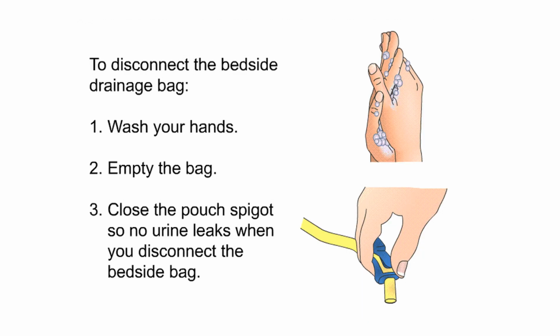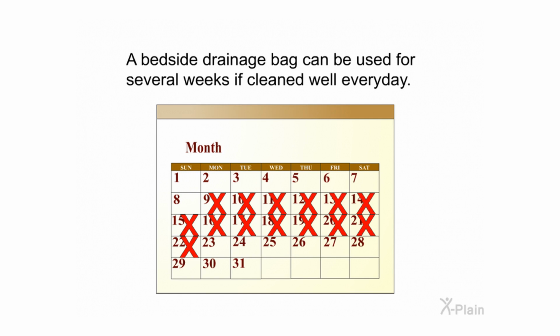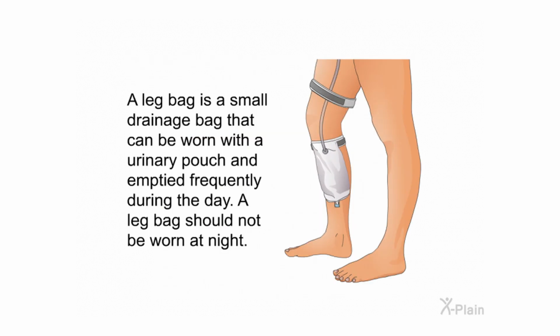To disconnect the bedside drainage bag: 1. Wash your hands. 2. Empty the bag. 3. Close the pouch spigot so no urine leaks when you disconnect the bedside bag. A bedside drainage bag can be used for several weeks if cleaned well every day. A leg bag is a small drainage bag that can be worn with a urinary pouch and emptied frequently during the day. A leg bag should not be worn at night.